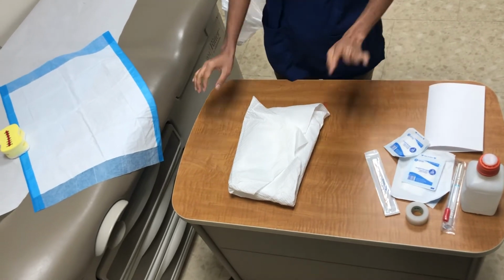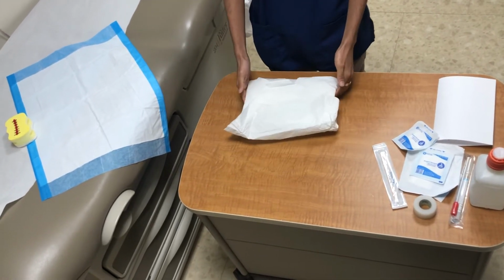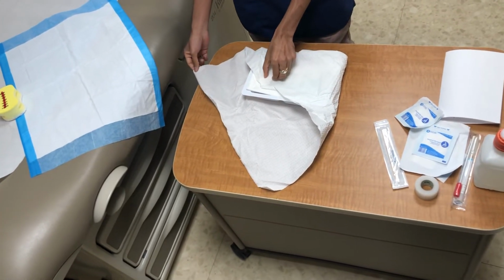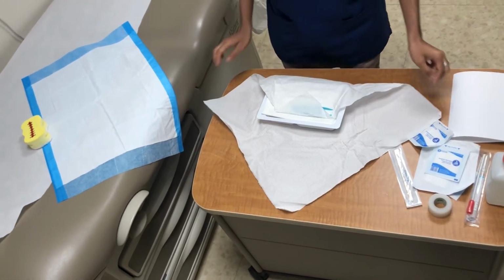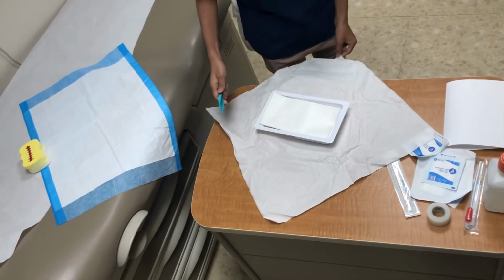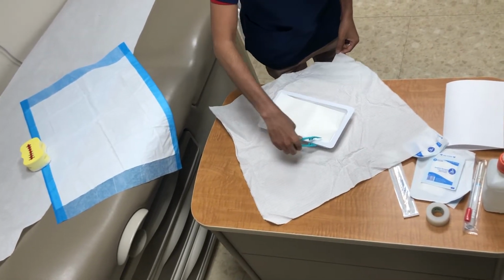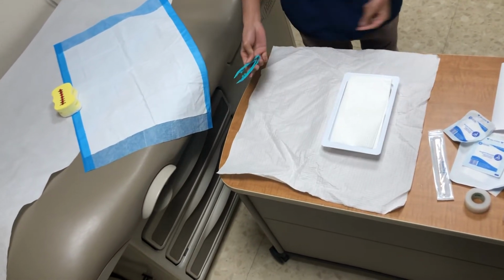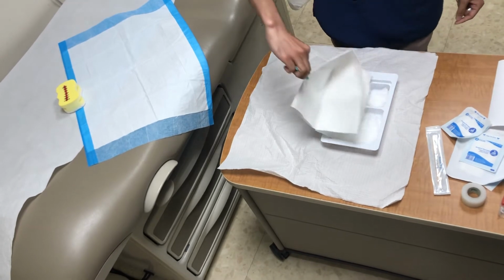They're ready. I'm going to open my sterile tray. So this goes away, open the edges. Now I'm holding it within a 1-inch border. I'm going to slip my finger under here and just take this out. I'm going to open it. So I'm just going to move this around like that. Just going to turn it. I'm going to take everything out.